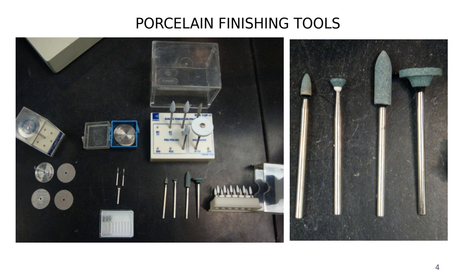Well, I can use a flame shape stone like this, and I start from a material that is coarse, and then I move towards the fine. Because even though we don't see it like we see it on the metal, when we start with the coarse burr, it leaves scratches. We don't see it very much on old ceramics, but they're there.